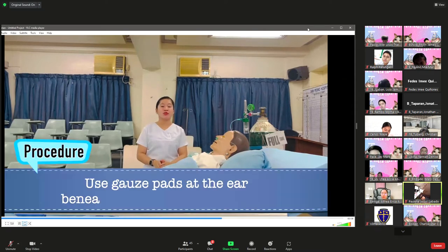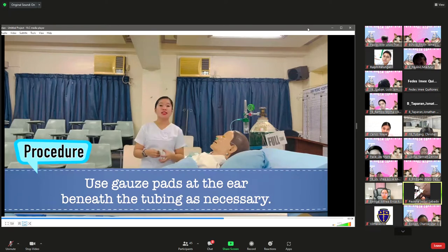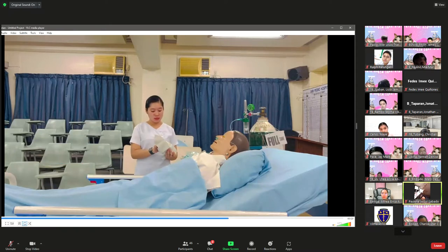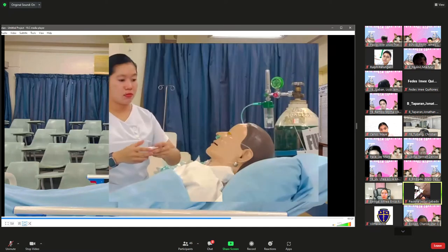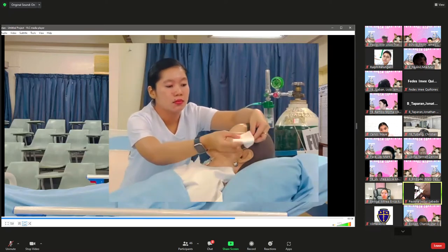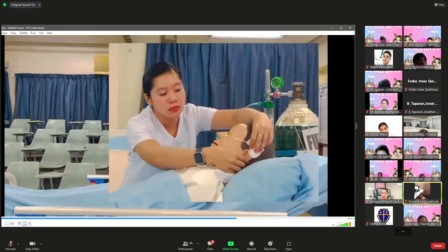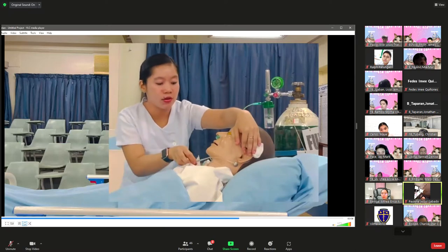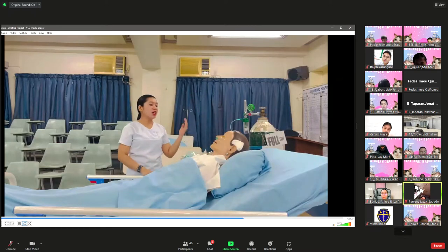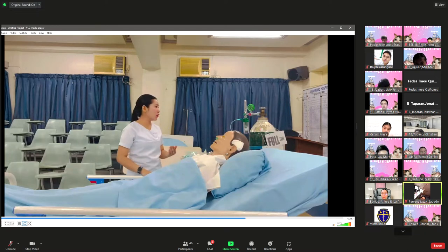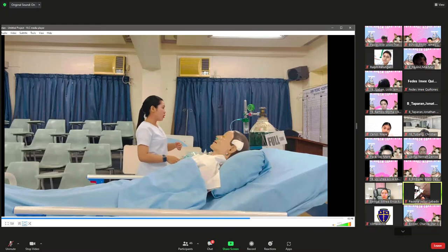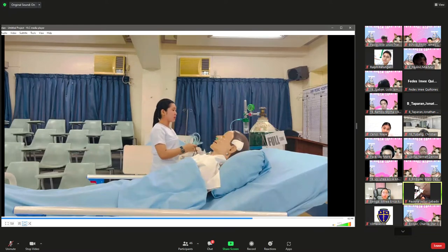Use gauze padding at the ear beneath the tubing as necessary to reduce irritation and pressure, protecting the skin — though this is optional. If the doctor orders a face mask instead, follow the same procedure as with the nasal cannula but replace it with the face mask. For example, if the ordered flow rate is 5 liters per minute, check that oxygen flows freely through the tubing, then apply the face mask to the bridge of the nose first, then position it over the chin, adjusting the strap snugly.